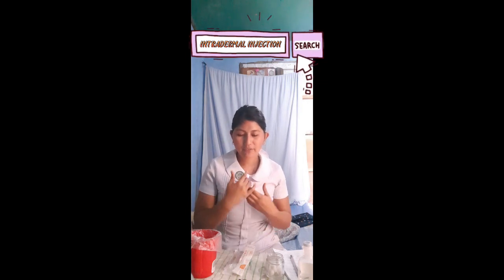To prepare the medication, of course, we need to have a syringe. So I have here a tuberculin syringe, which is ideal for skin tests and intradermal injection. I also have here a 23 gauge needle for intramuscular injection, and an aspirating needle.